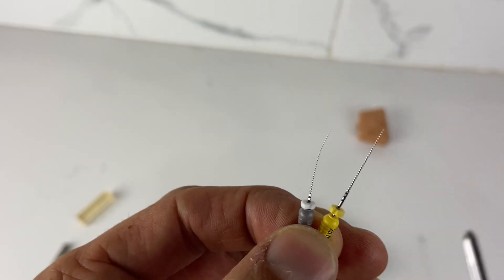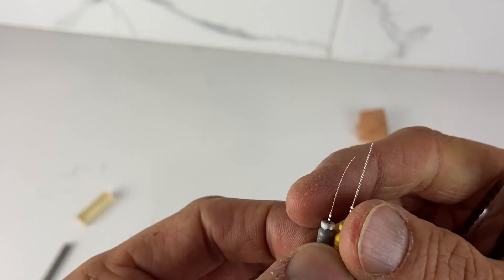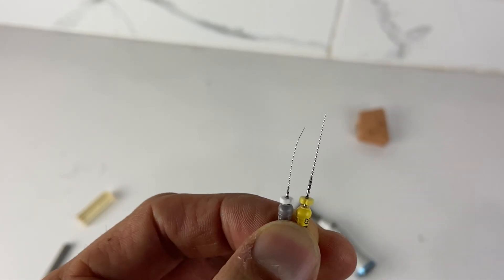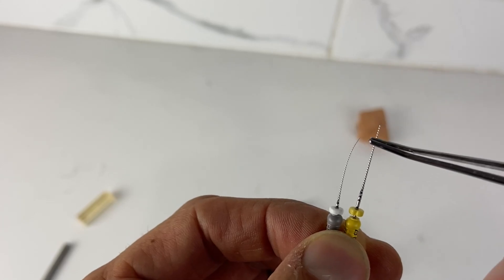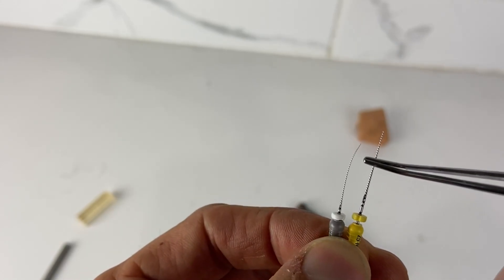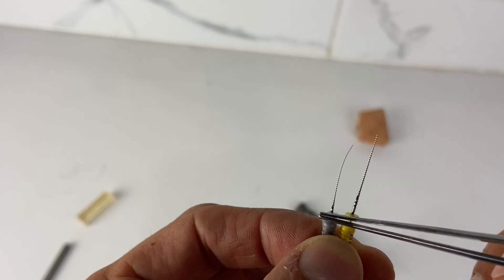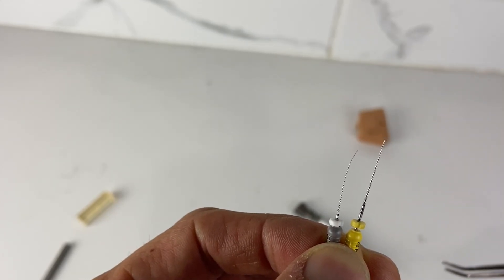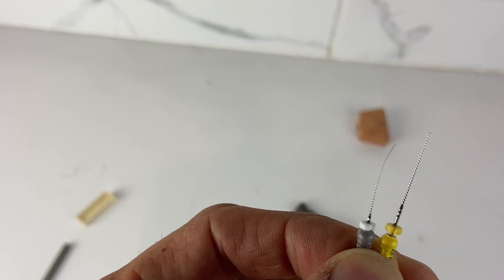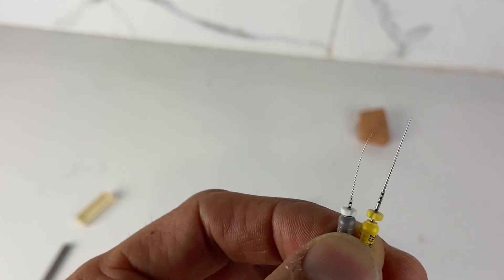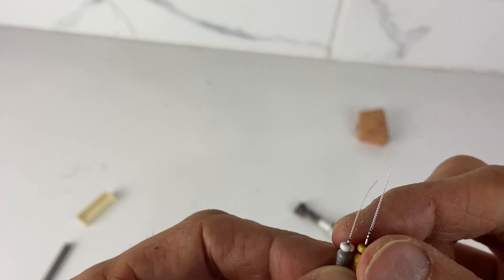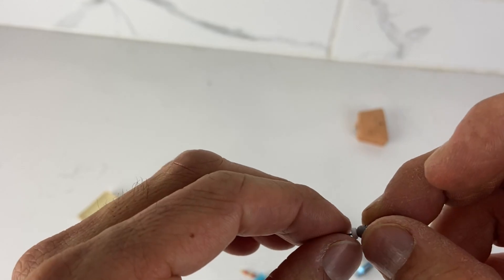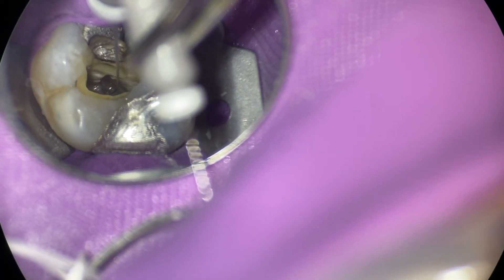The next one is standard for, say, we're going to be tackling an upper second molar. What I'm going to have is a 6, 8, 10, and a 15 potentially of the short 21 millimeter files. Now, if you're starting to do more endo, my experience in general practice, like in different clinics, they don't normally have a wide range of different lengths.